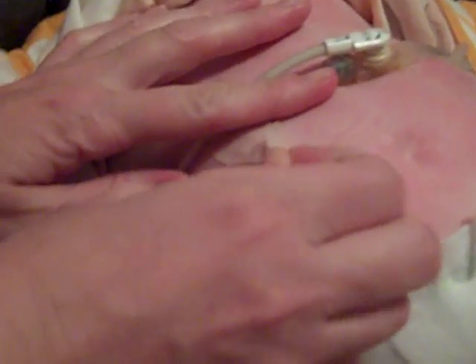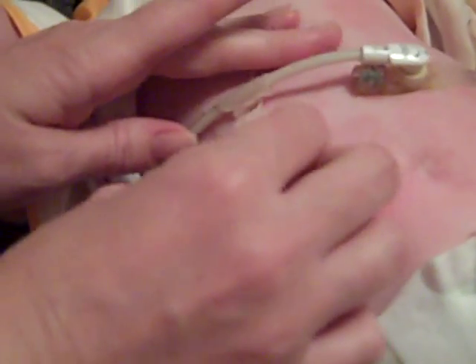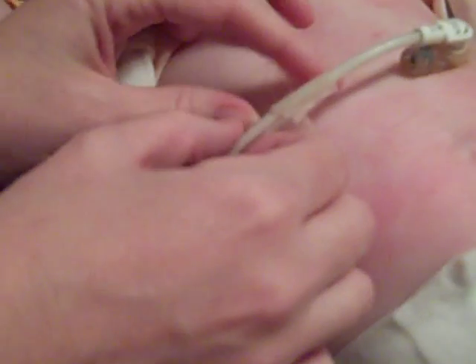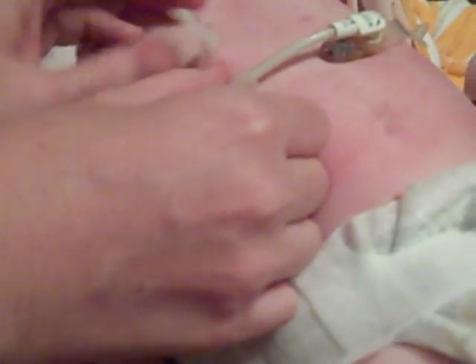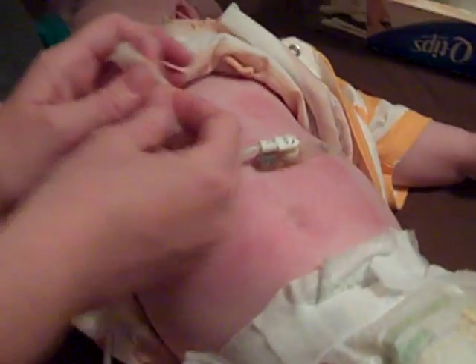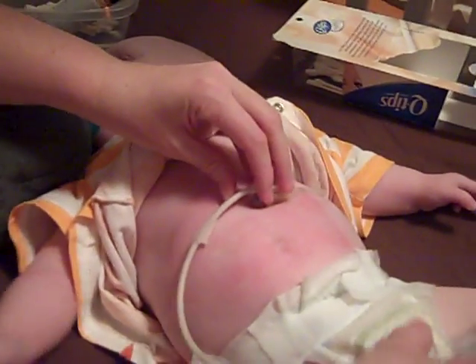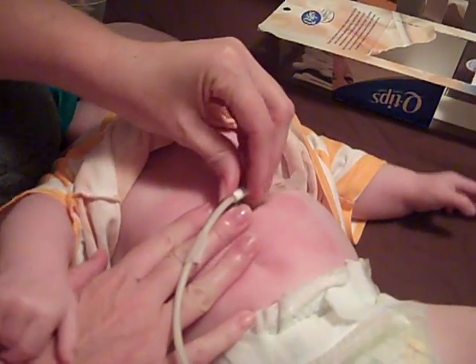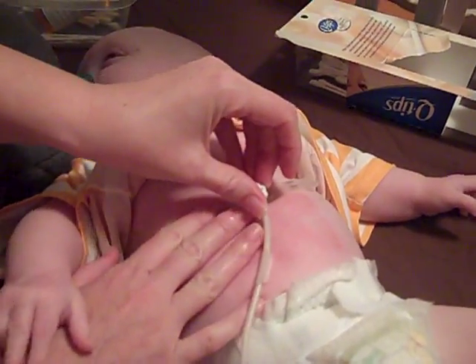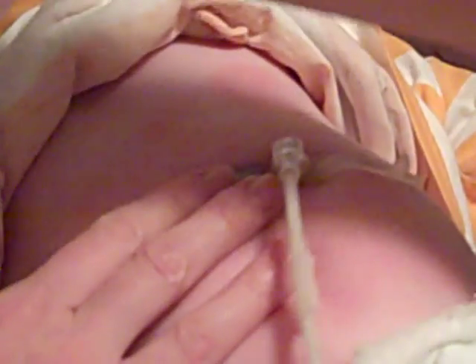So anyway, this is our daily routine. And that little piece of really stuck tape is going to come. But that stuff, I've stuck it on myself before. It doesn't hurt. So anyway, now I'm able to take this tubing, and sometimes it'll just twist. And in this case, it looks like it might do it. I don't have to cut it.